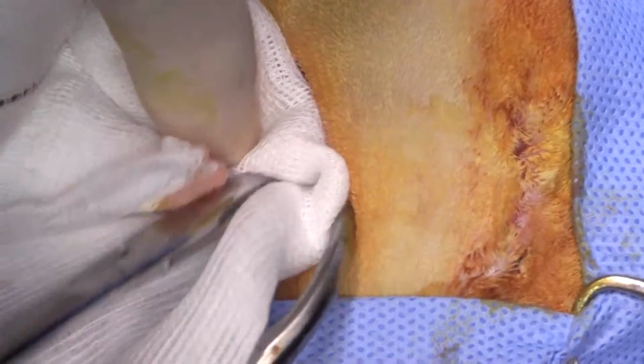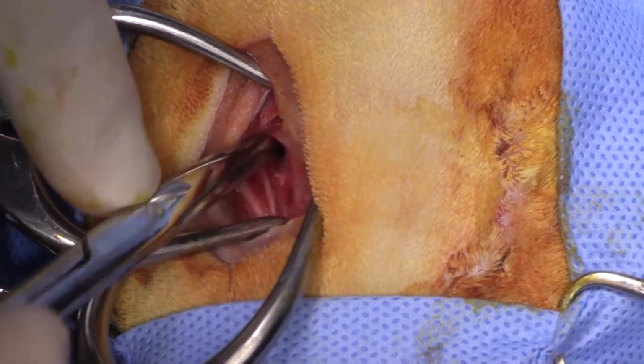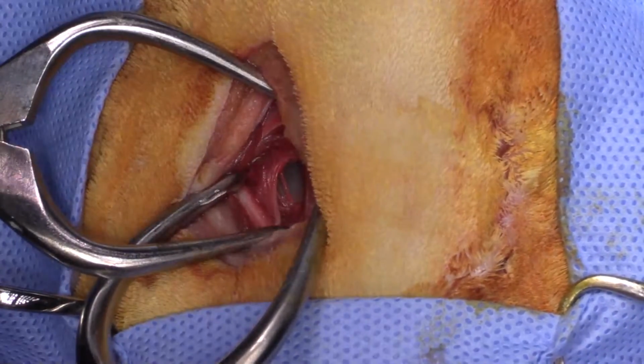And the prognosis for these is great when you do a ventral bulla osteotomy. If you just avulse it, I think there's about a 60% chance that it'll recur.